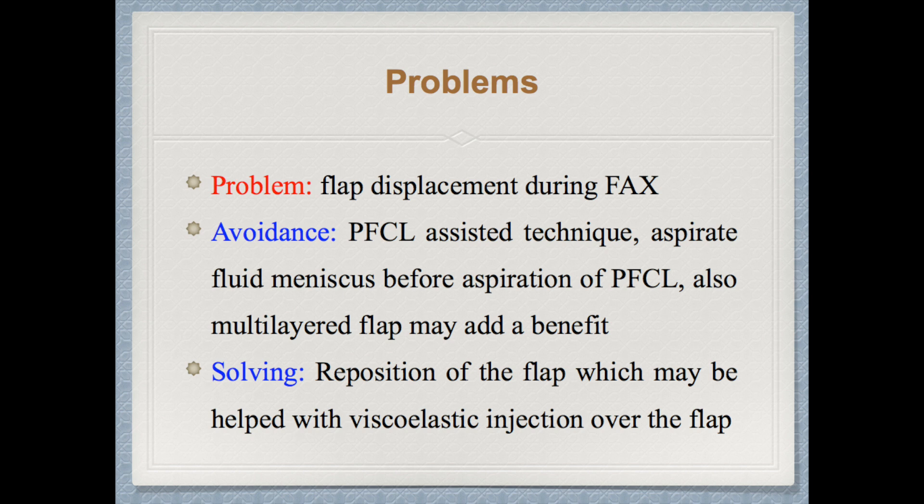To solve this problem, simply reposition the flap, which may be helped with viscoelastic injection over the flap to keep it in place. After performing the inverted flap technique and going for fluid-air exchange, aspirate the fluid in the interface between the air and the peripheral PFCL. Keep the fluid needle at the edge of this bubble and aspirate the fluid at the side of the PFCL bubble, waiting until the peripheral PFCL bubble merges with the fluid. Aspirating the peripheral PFCL prematurely can cause fluid to get on the surface of the macular hole ILM flap and may displace the flap.